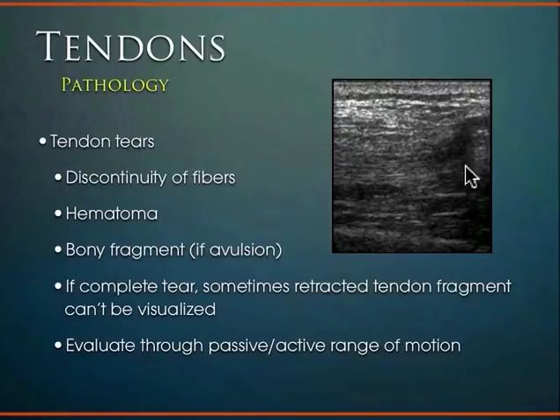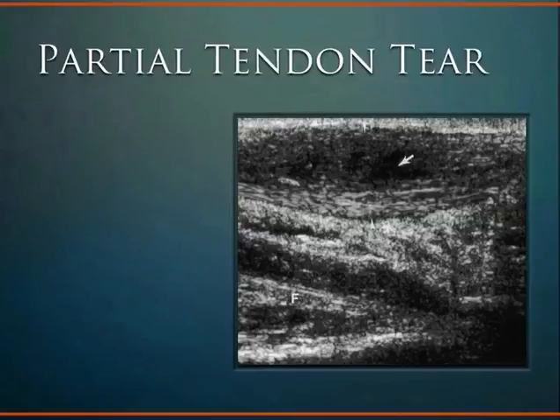in the tendon itself. And then again, it's very dynamic, and so it's pretty neat. You can then flex that tendon through its range of motion, and you actually see retraction of the tendon, instead of full nice smooth movement. So you can actually see that tear functionally, and that can be very helpful to evaluate how significant the tear is.